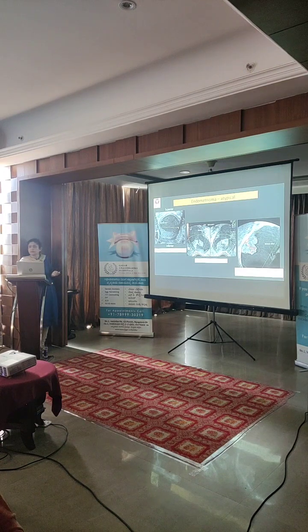But not always are these contents so clear. Sometimes you have some debris lying within an endometrioma. Here you have a clot. You know it's hyperechoic and avascular. And here was another patient who was diagnosed as a clot within an endometrioma.